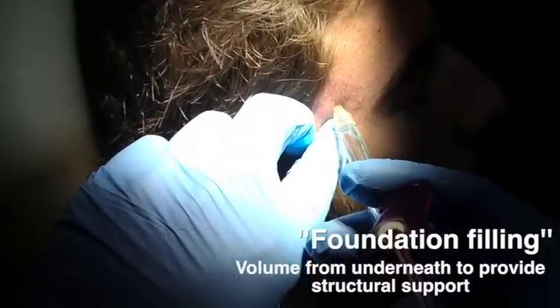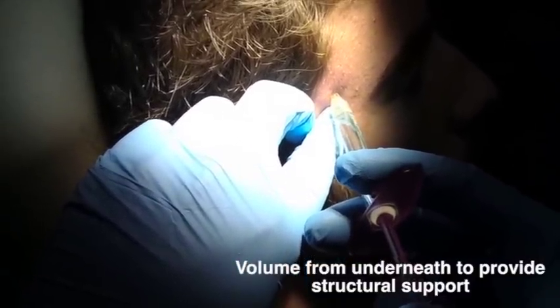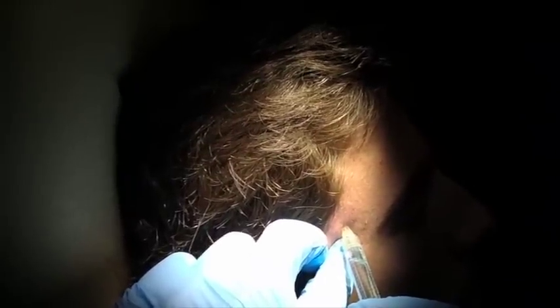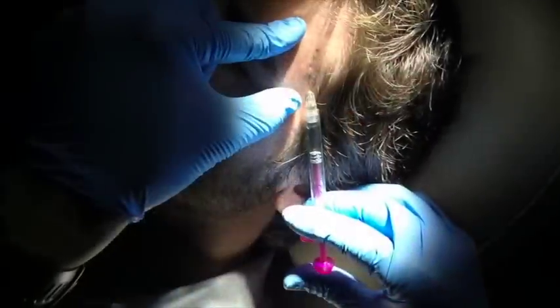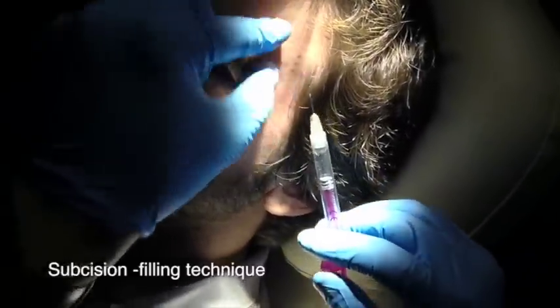The atrophic scars — I'm lifting the entire area. I'm on periosteum in this area, being very careful to feel the temporal artery and not hit that. This is the superficial subcision filling technique. I break up the scars first using a 30-gauge needle.